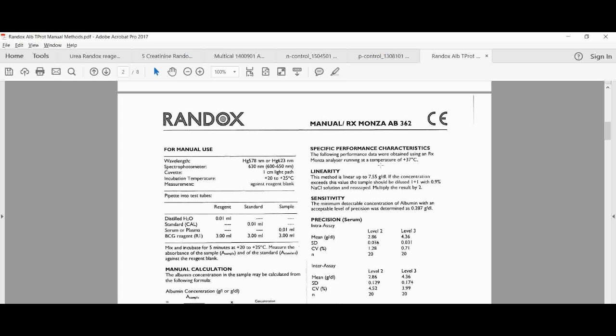On that standard curve, at a specific low concentration you will have erratic results, and at a specific high concentration you're also going to have erratic results. So you're only going to use the range where you find a linear line from the low value to the high value. Anything out of that linear line means it is non-linear.